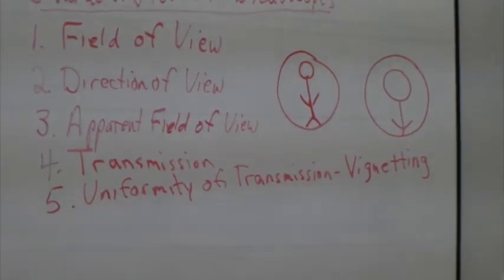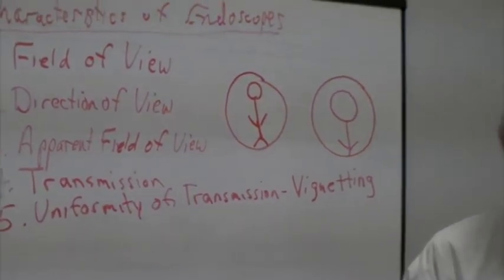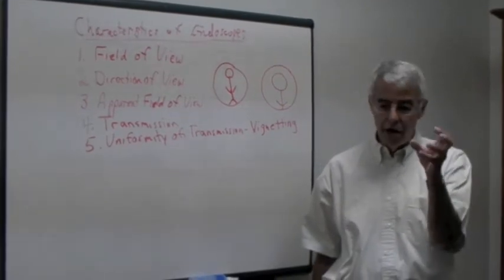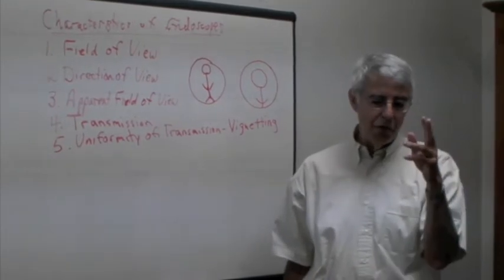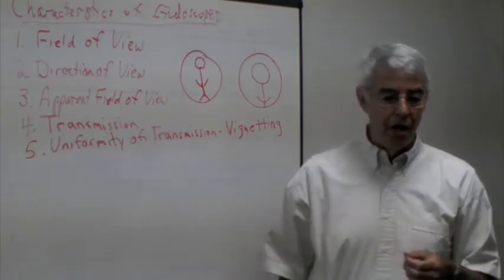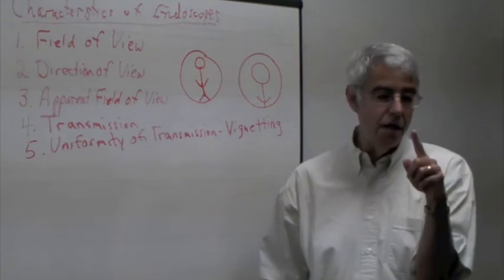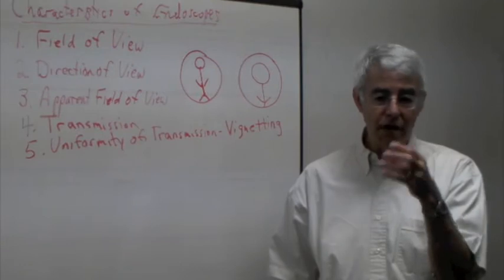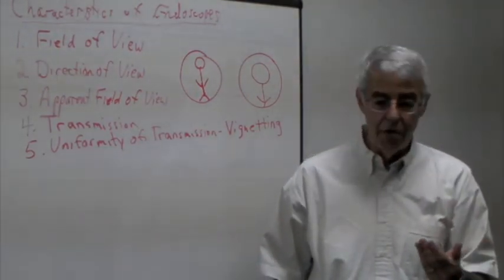So again, the surgeon says, I got the scope repaired, yeah, I can turn the light up and I can see what I need to see bright enough in the center of the image, but I used to be able to see what was going on at the edge of the field, and now I can't. It's always dim. And if I turn the light up more so I can see what's going on at the edge of the field, well, now the center of my field is saturated, and I've got a whiteout condition. I can't see anything. It's too much for the dynamic range of the camera.